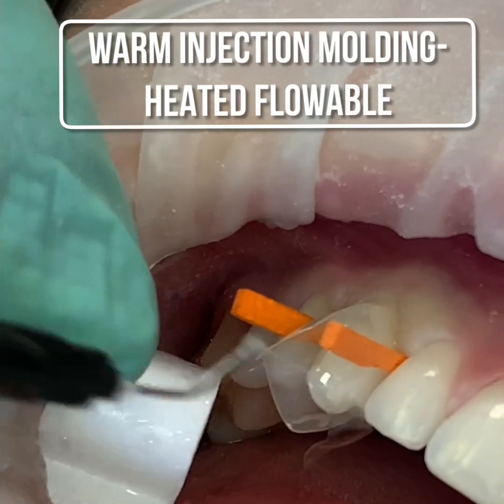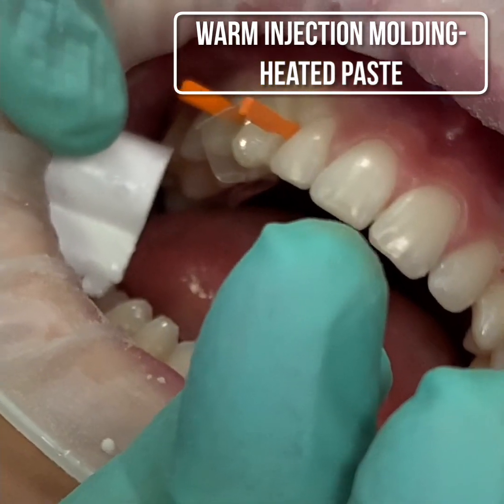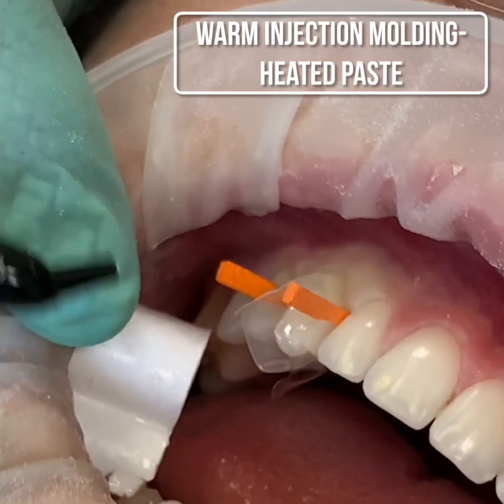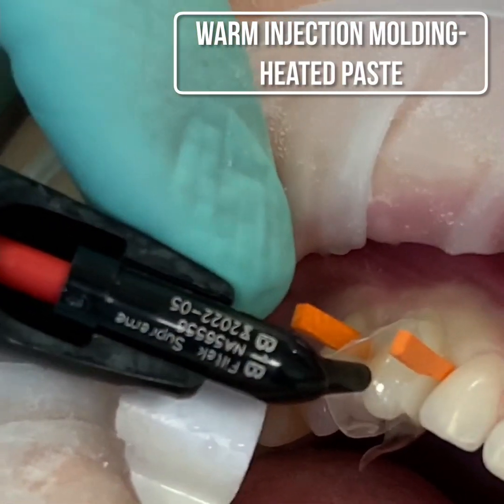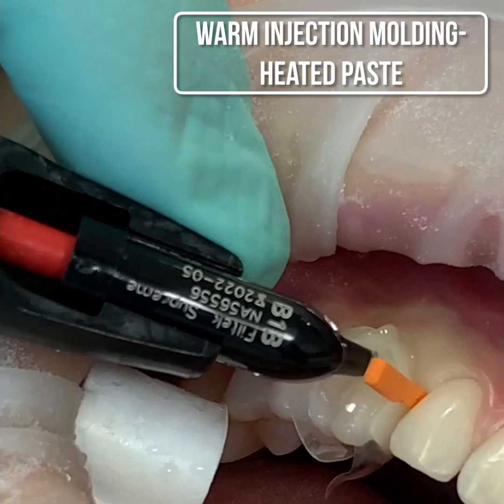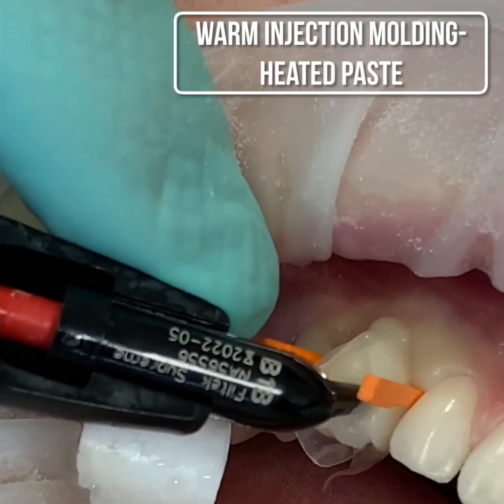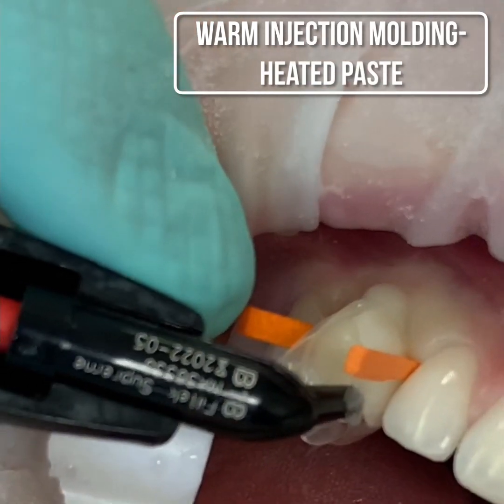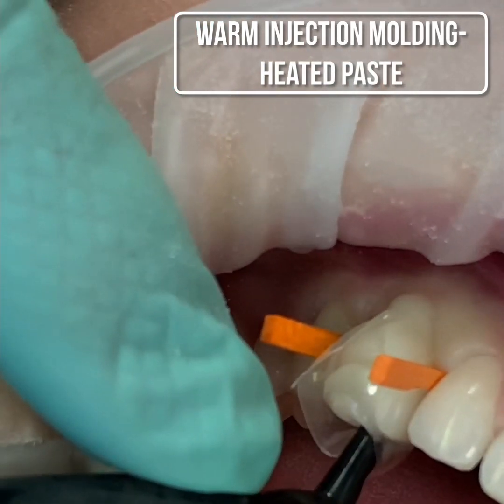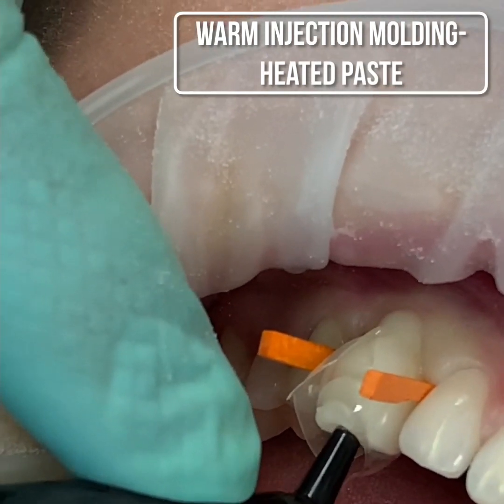Next, we'll use a warm paste that is injected on top of the flowable composite so that it pushes it in a hydrodynamic fashion and seals itself around the tooth really well. But this leaves the front part of the tooth, or the facial part of the tooth, really bulky, and that part of the tooth is not shaped like a natural tooth structure.